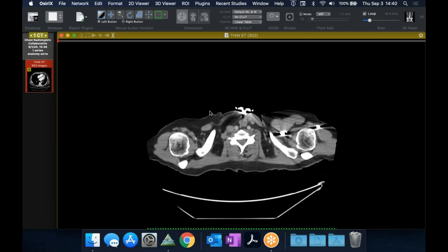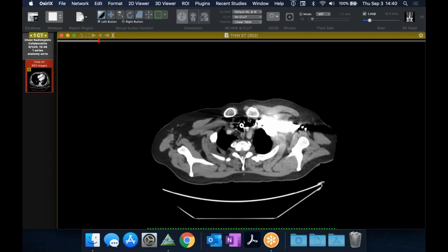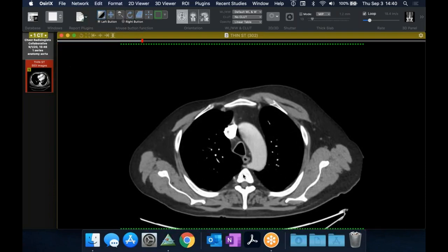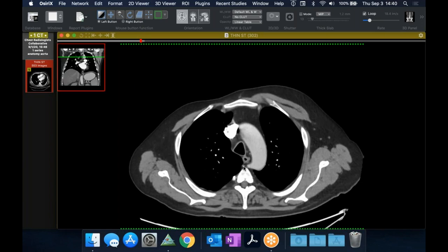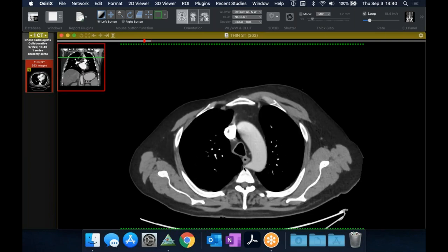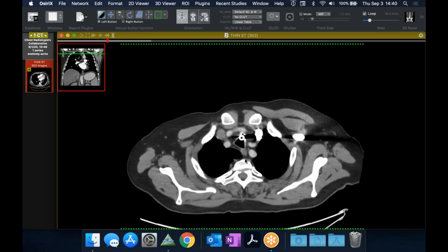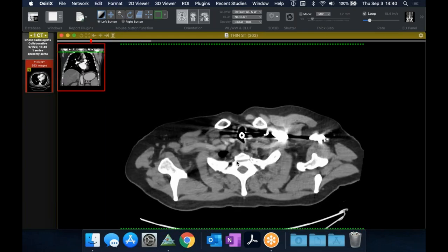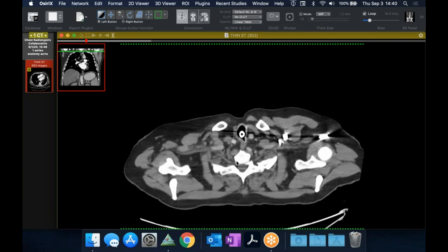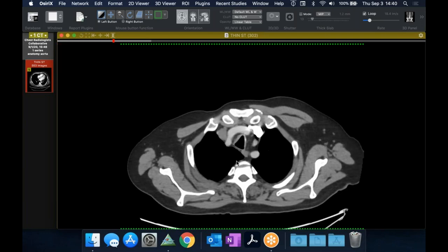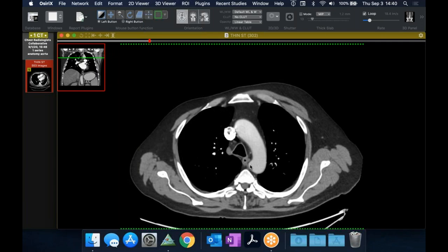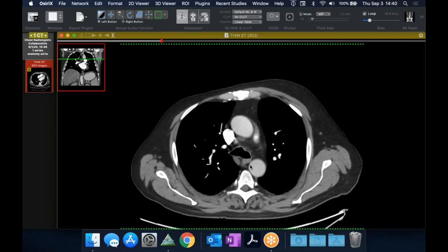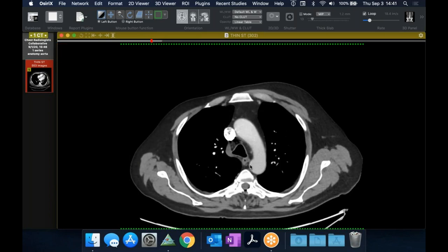This is a fun anatomic variant. The patient has this little diverticulum coming off the proximal descending aorta, which seems to be a trunk that gives rise to the bronchial arteries, but it also gives rise to this anomalous vessel that crosses the mediastinum and becomes the right vertebral artery. So this is an aberrant right vertebral artery coming off what appears to be the bronchial artery trunk — a little diverticulum right there. I've seen cases where both verts come off the aorta, but this is the first time I've seen one come off the bronchial artery trunk.